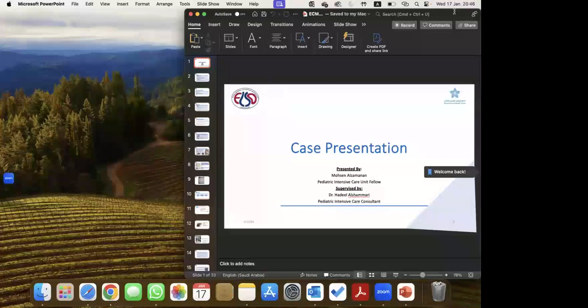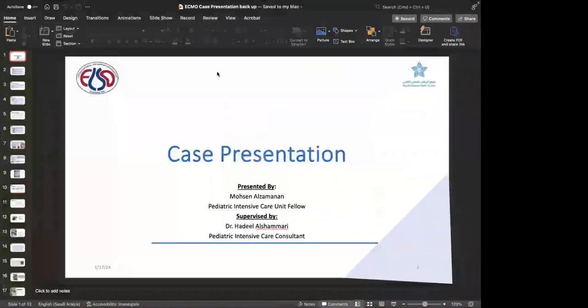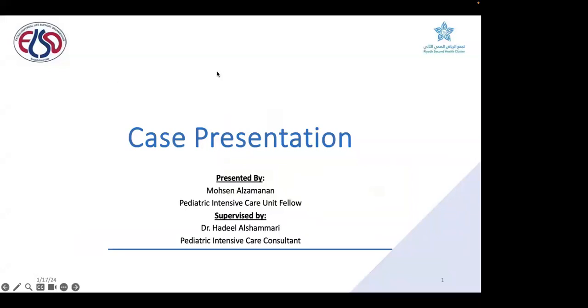Yeah, thank you, Dr. Iman. Usually our setting is determined based on the body surface area for each patient and the age as well. And also it's based on the type of the ECMO that you're using. Regarding the ultrasound, she's almost 12 months old and it was doable for her. And regarding the MRI, there was no MRI done for her during her admission. But clinically, she was doing great, and there is an appointment for the MRI to be done as a follow-up post-ECMO decannulation.